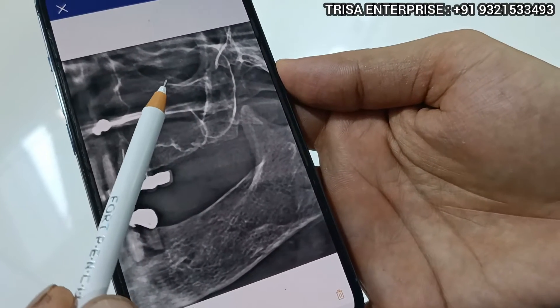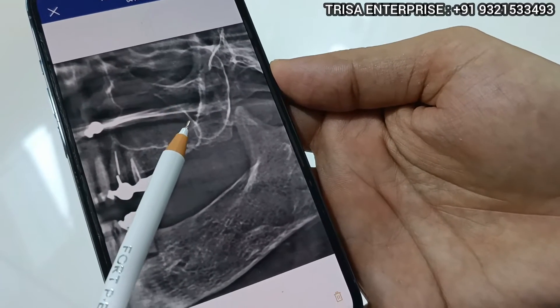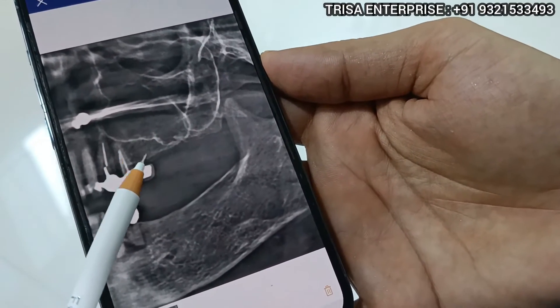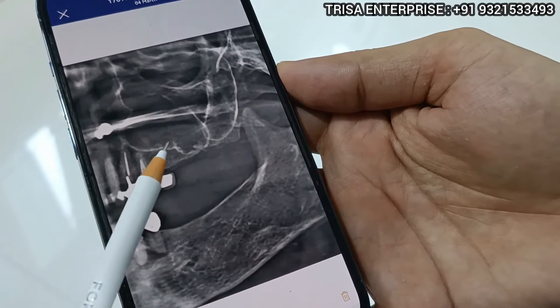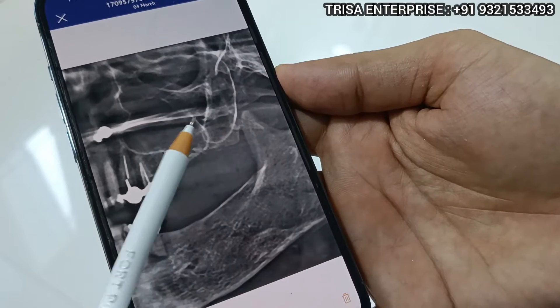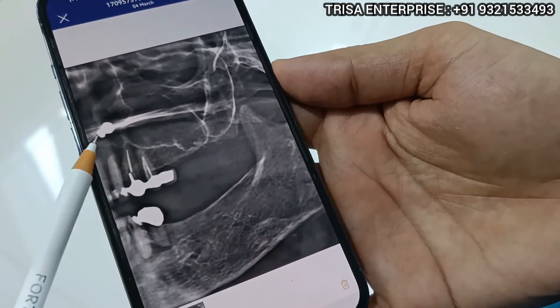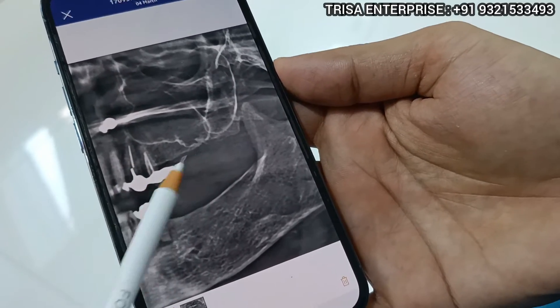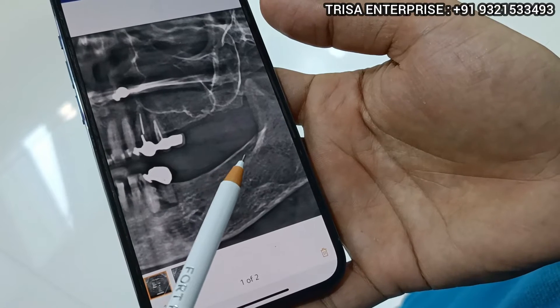In such situations it is also recommended to add a zygomatic implant. You can see the zygomatic bone here. The plan is: a zygomatic implant, one small implant if required here, and two implants here. That's the plan. For the pterygoid, in such a weak situation I'm not fully certain, but we can attempt it — so one pterygoid, one zygoma, nasal implants, and one short implant is the plan.